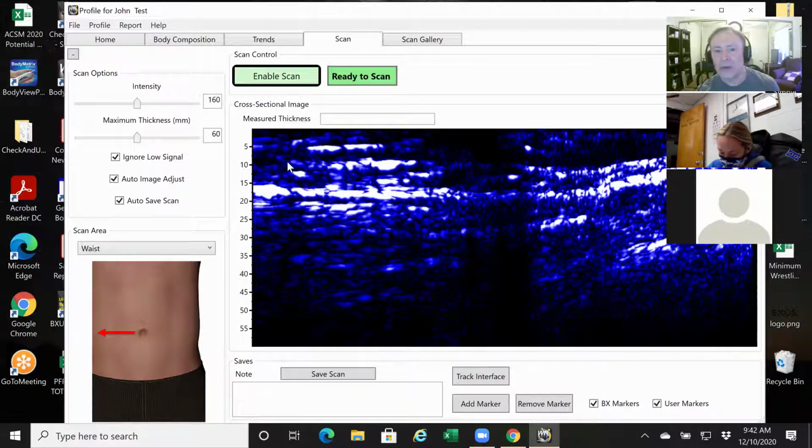It's a cross-sectional image. So in terms of interpreting fat thickness with the image, my focus is right here on the very left-hand side. Why? We're starting that image at our site point, and as soon as I press that button, we're really at the site point as the image renders right here, okay?